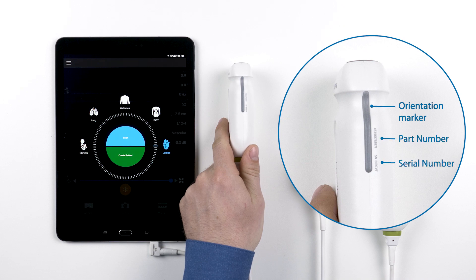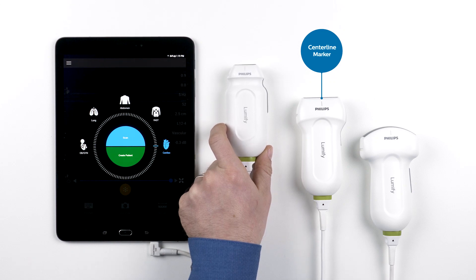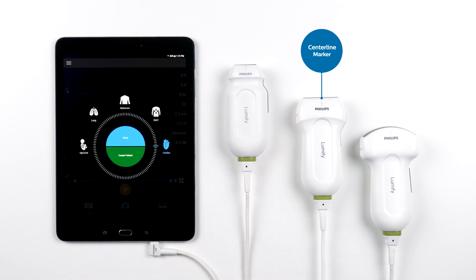Here you will see the part number and serial numbers of your transducer. This will be important to know if you ever need to speak with your Philips service or account representatives. This is the centerline marker. It corresponds with the centerline marker that you can activate as an overlay on your ultrasound image.